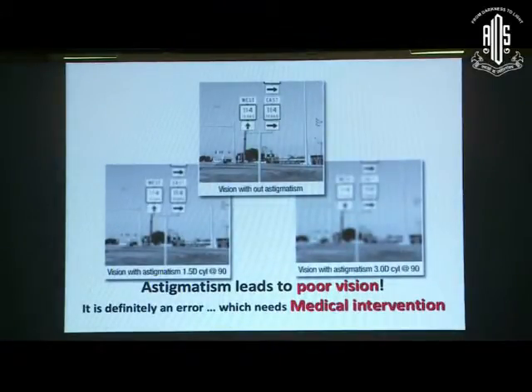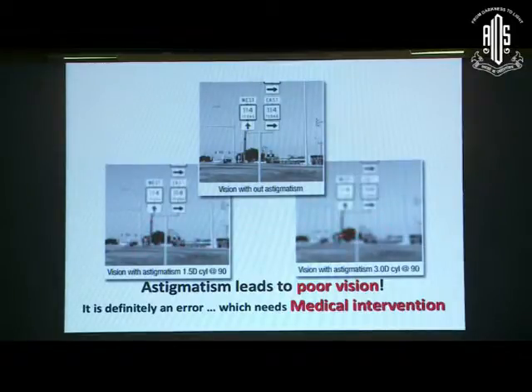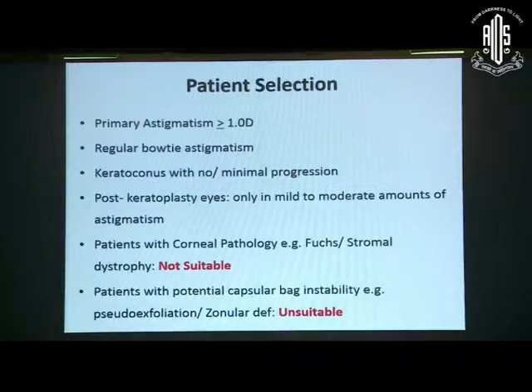Now, why does it need to be corrected? The basic reason is that the crispness of vision comes only if you don't have astigmatism like this. Otherwise, if you have varying degrees of astigmatism, the crispness of vision goes away. So a patient who has significant astigmatism, anything more than 1 diopter these days people consider. Even for 1 diopter, yes, there are models which correct for 0.7 diopters at the corneal plane, and then nearly 0.2 to 0.25 is the spherical equivalent, surgically induced astigmatism. So nearly that also is corrected. So anything above 1 diopter, earlier 1.5 was the cutoff. Now anything around 1 diopter can be an indication for toric IOL implantation.